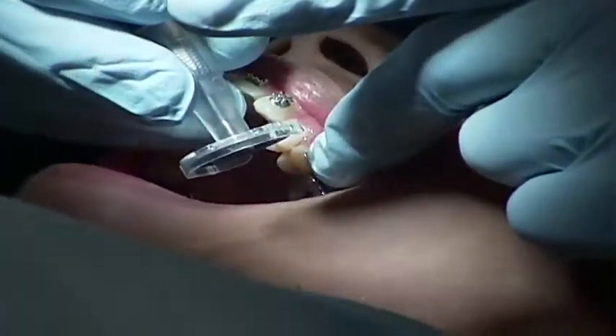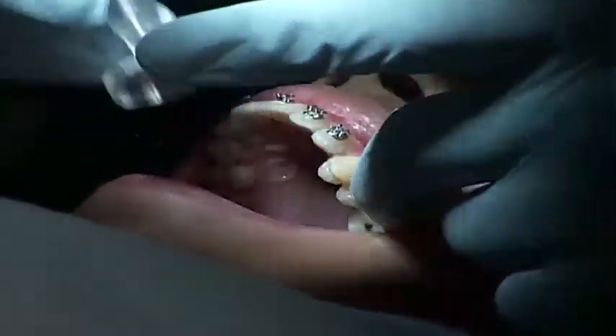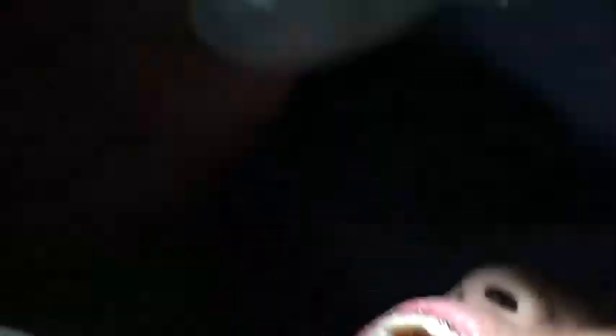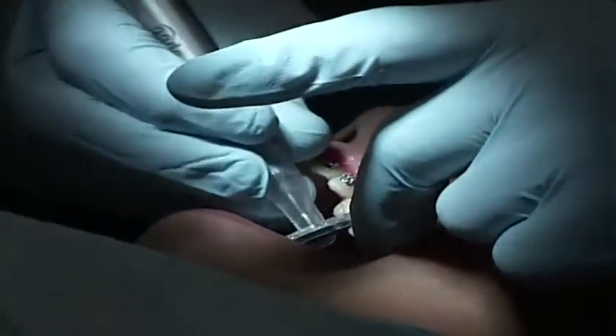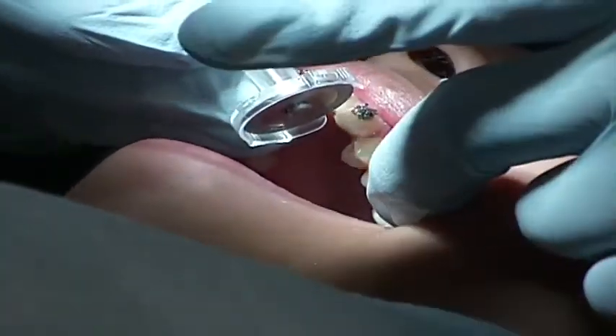In this position, the finger is retracting the cheek on the left, and I'm resting the guard up against my finger to add stability to the process. You can see I'm doing the entire maxillary left quadrant with ease.